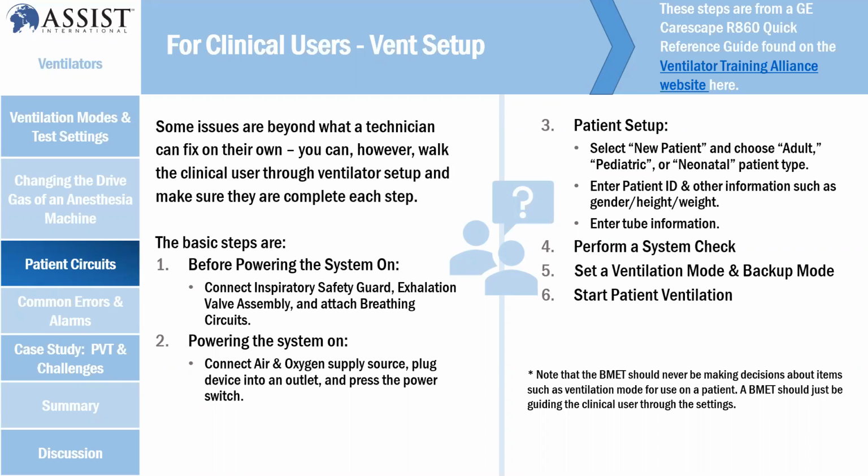So set the mode to backup and keep the machine ready for a patient. This is what you have to do every day. Every day and every time before a patient is going to start using the ventilator, you need to do this type of verification. By doing this, you know your ventilator is ready to use on the patient.